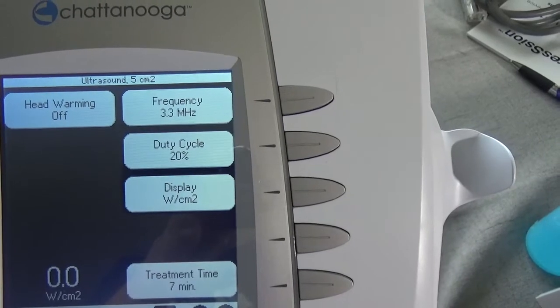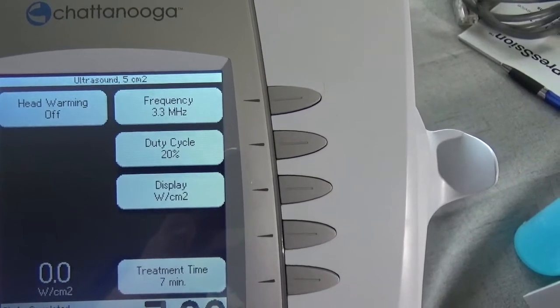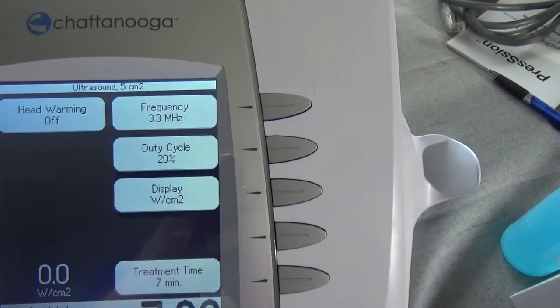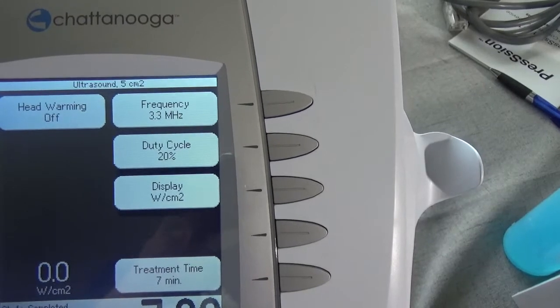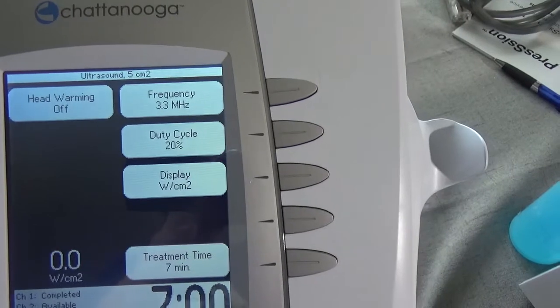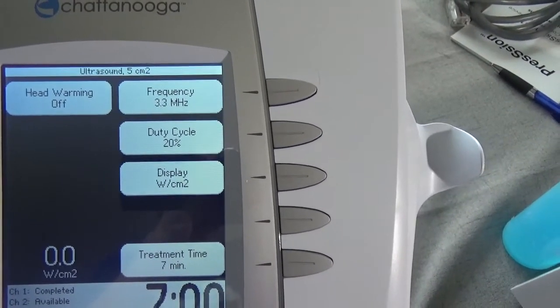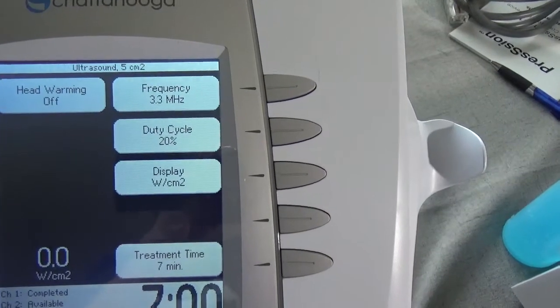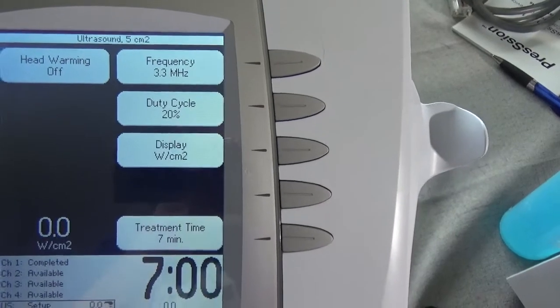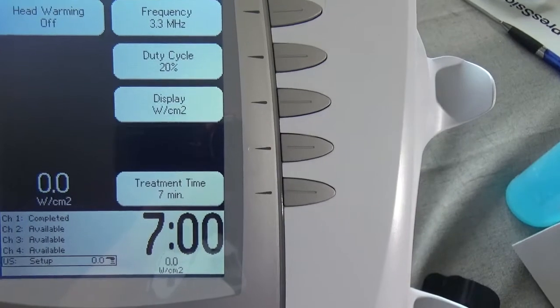Sometimes, if the skin is totally intact, you may be looking for the deeper setting. That's the difference. This 3.3 is a more shallow, superficial depth, but in this instance, the particular area we're going over has no skin, so the impedance is greatly reduced due to that. And our 20% duty cycle, and so you can figure out your ERA for the size of the wound.